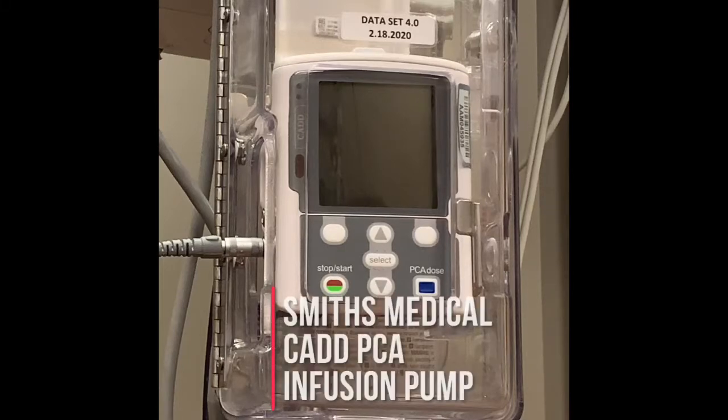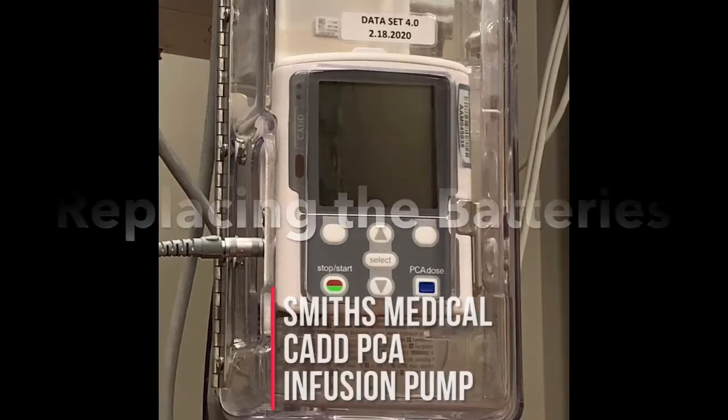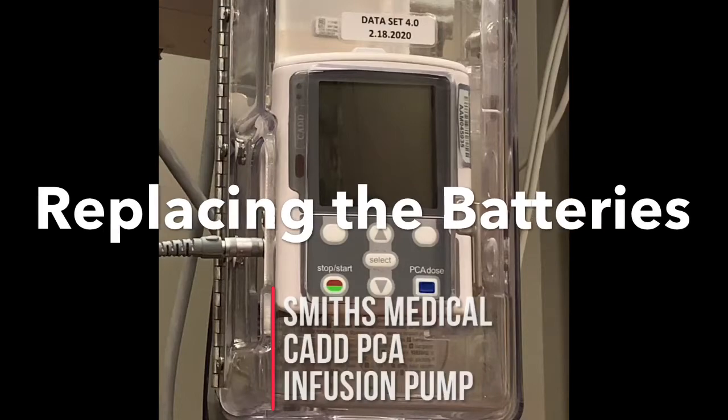While the syringes for the LifeCare PCA pump are unavailable, at St. Mary Mercy Hospital we will be utilizing the Smiths Medical CADD PCA infusion pump. In this video, we will discuss how to replace the batteries.